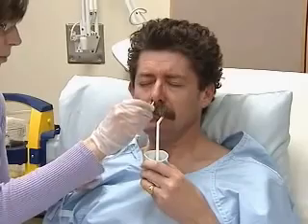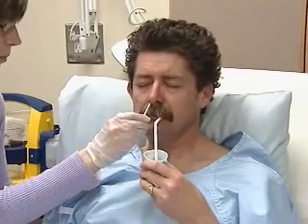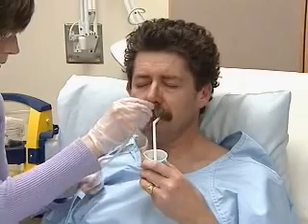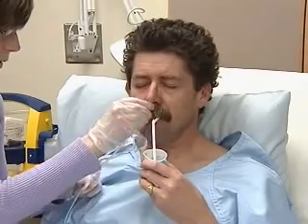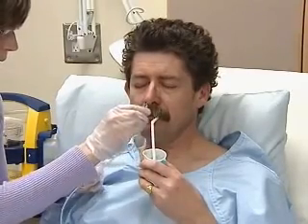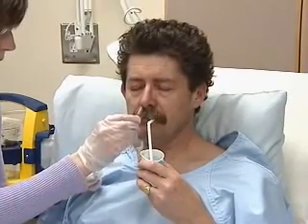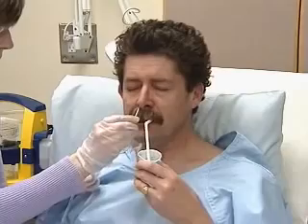You'll advance the tube by an inch or two with each swallow. The patient may cough or gag if the tubing has accidentally entered the larynx. You can pause, withdraw slightly, and ease the patient with a sip of water. Be careful — there is a risk of aspiration.